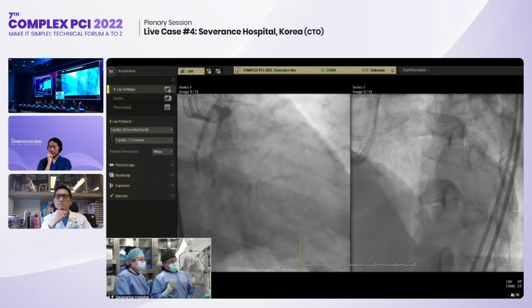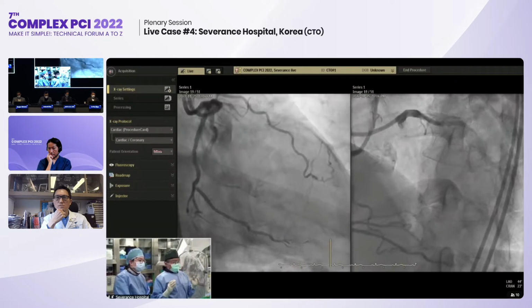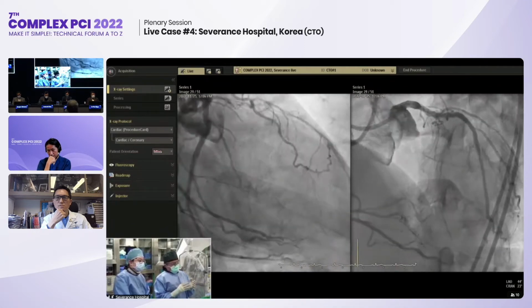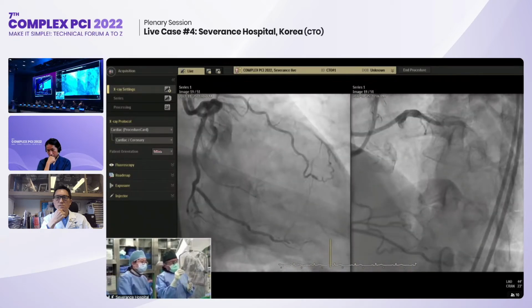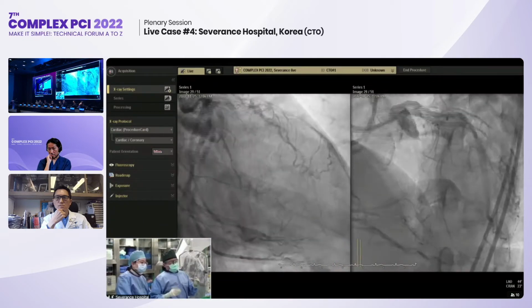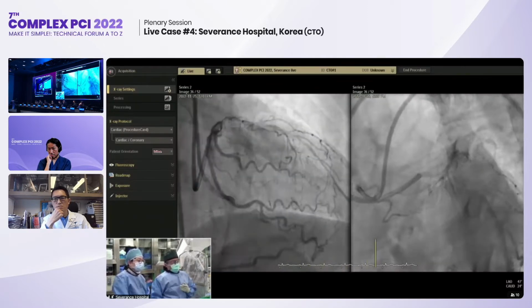Okay. So the CTO portion, meaning the proximal and distal portion, is really quite similar. But in the caudal image, the septal collateral is a little prominent, but some initial point and some mid position is very tortuous. But you can see the PD2 septal is more clear. So we change the direction. Next angiogram. This is the cranial and spider view.